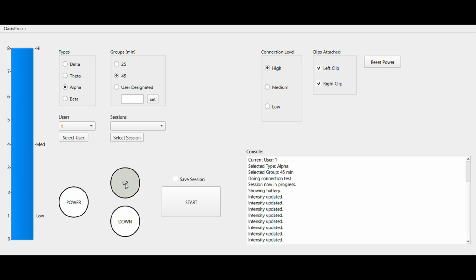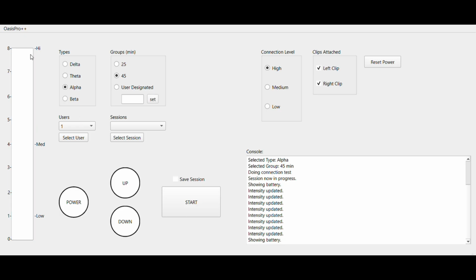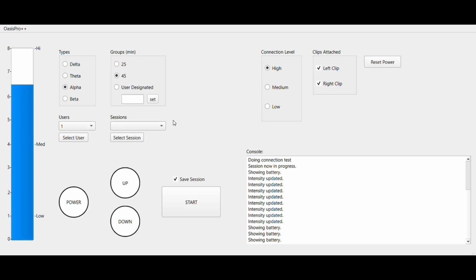So if I up the intensity to 8, now you're feeling the shock. And you'll see the battery shows it's draining slowly. We'll wait till it ticks one more time. And you'll see it keeps draining. You can hit the save session box here. What that will do is at the end of the session, it will save your parameters so you don't have to enter it again for the specific user.